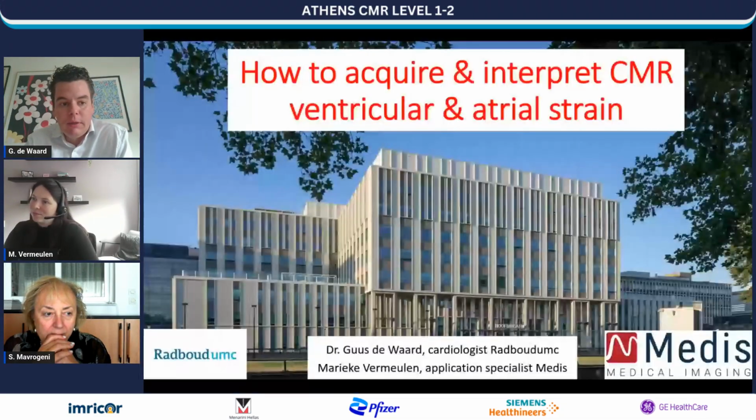All right, thanks for this introduction. My name is Dr. Guus de Waard. I work at the Radboud University Medical Center in Nijmegen, the Netherlands. And we will perform a session together with Marieke Vermeulen. She works as an application specialist for Medis, a software company.